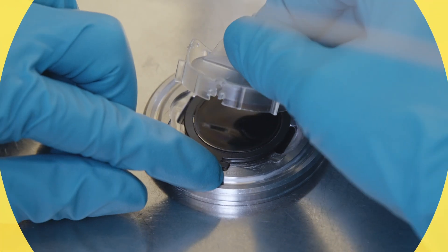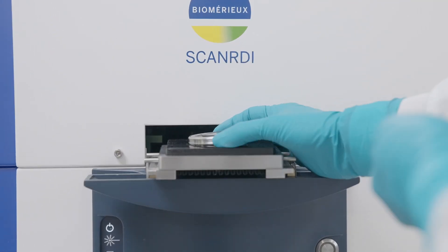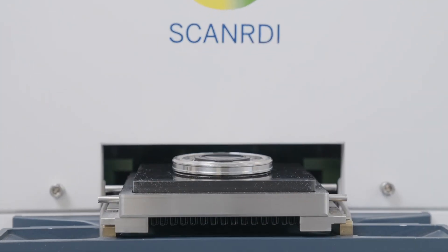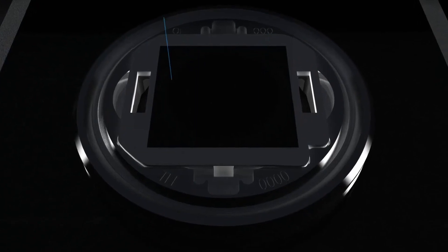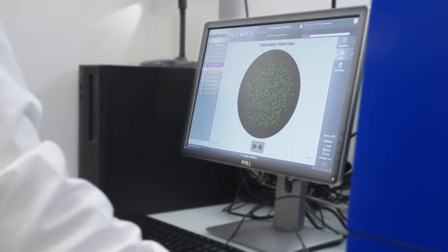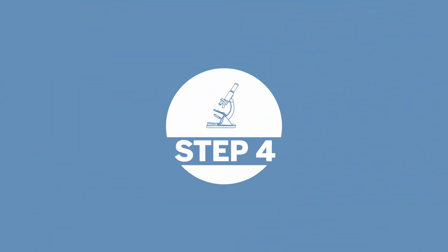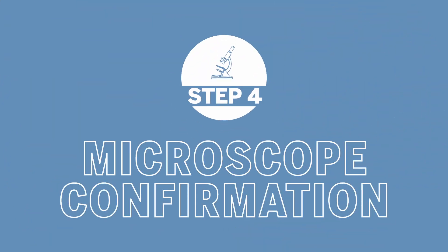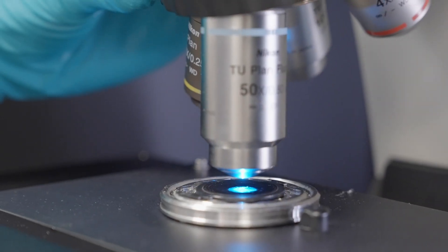ScanRDI analyzes the entire membrane in less than four minutes to detect any fluorescent events. The software utilizes powerful discrimination to exclude non-microbial events. Confirm contamination events with your own eyes using the microscope's automated stage.